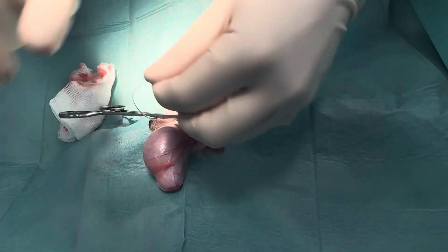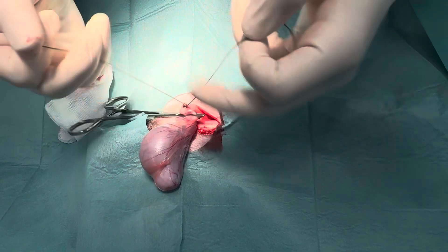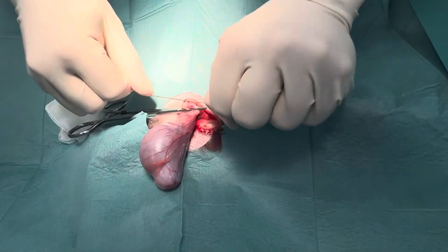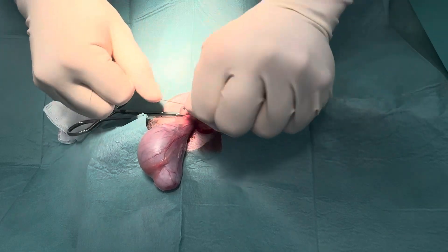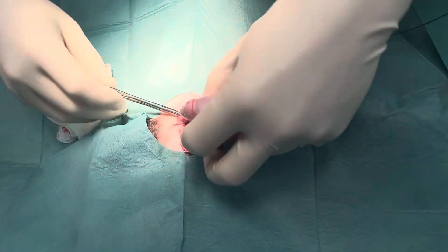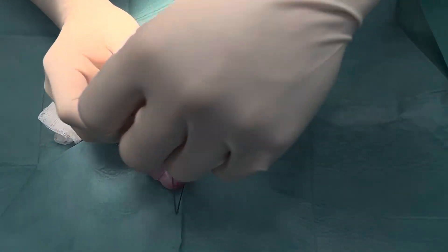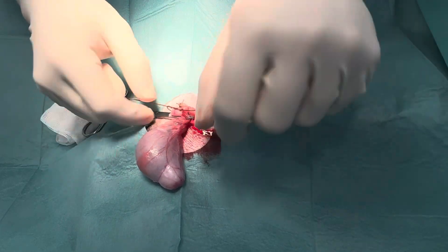I don't tend to do the ties too strong. I normally do about five to six throws on my hand ligatures. You can use Vicryl or PDS and do surgeon's knots — not a problem. These are very routine and shouldn't have any issues. So that's one ligature done. Then I unclamp, go a little bit higher up, and that's where my second ligature is going to be, just above the previous one. I find it helps hold the ligature really well.